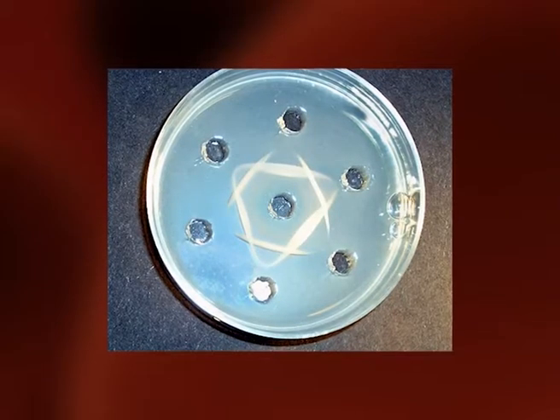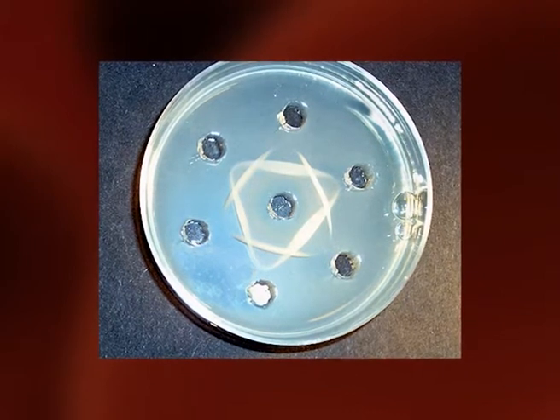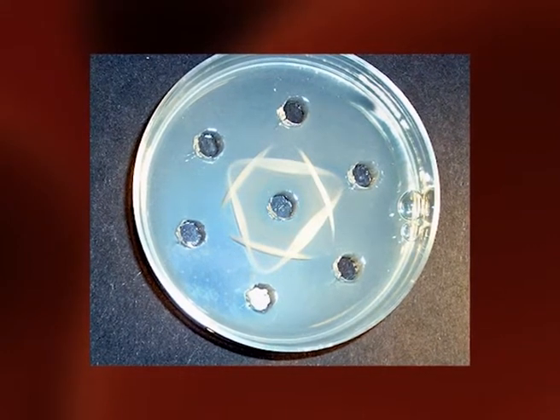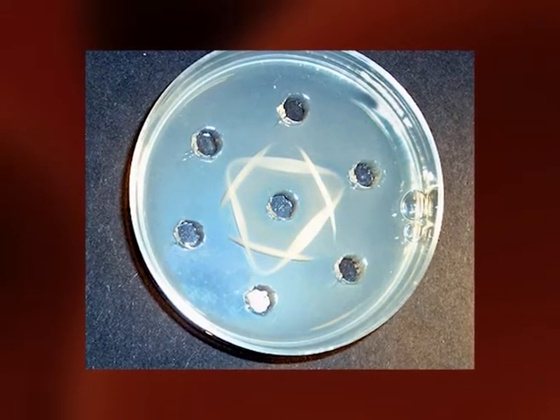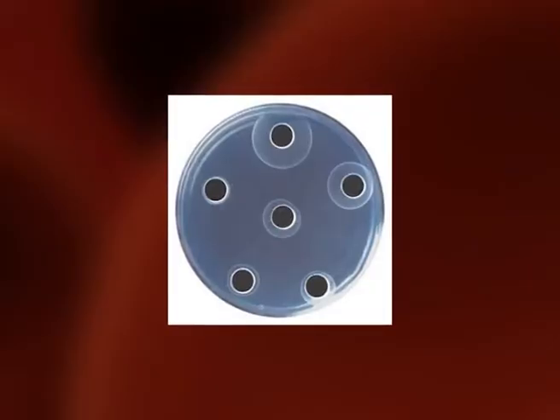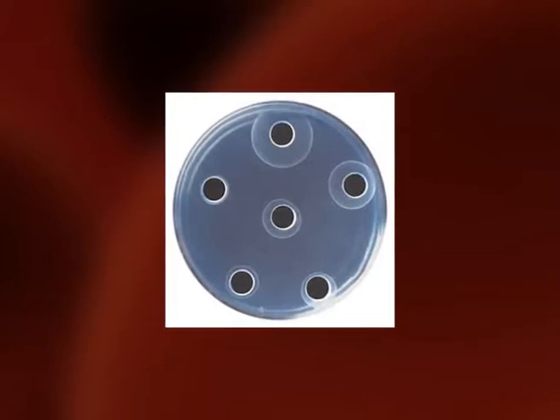The assay can be carried out in a liquid or a semi-solid medium such as agarose gel. The semi-solid medium can stabilize the diffusion process and reduce interference such as convection, which is the movement of molecules within the liquids. There are basically two types of immunodiffusion techniques. They are single diffusion and double diffusion. Let us talk about single immunodiffusion. A concentration gradient is established for either an antigen or an antibody in this particular technique.